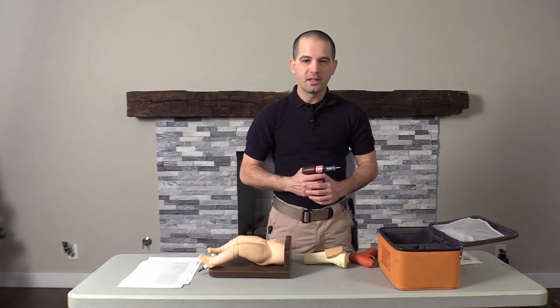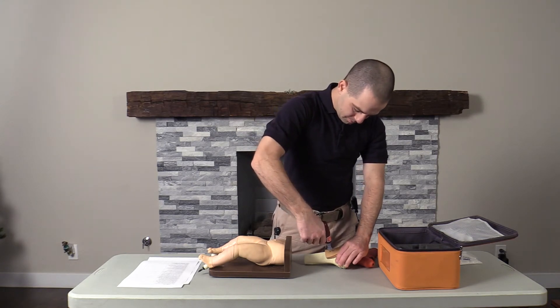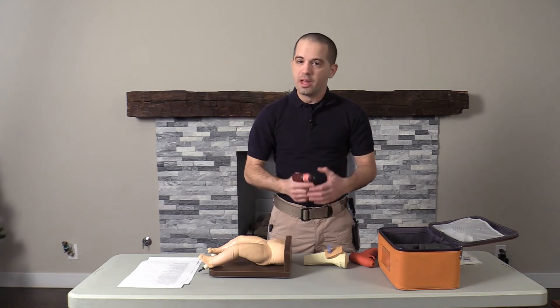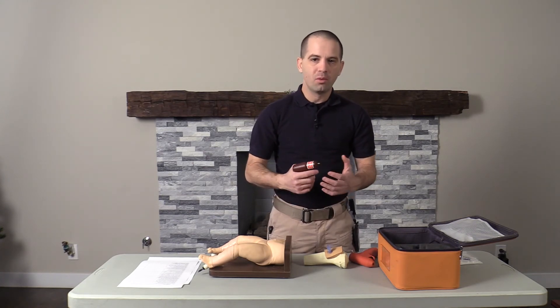And now I've got the EZ I.O. driver — listen to how this one sounds. As you can see, they both accomplished the job. I just feel the EZ I.O. has a little bit more power to it.